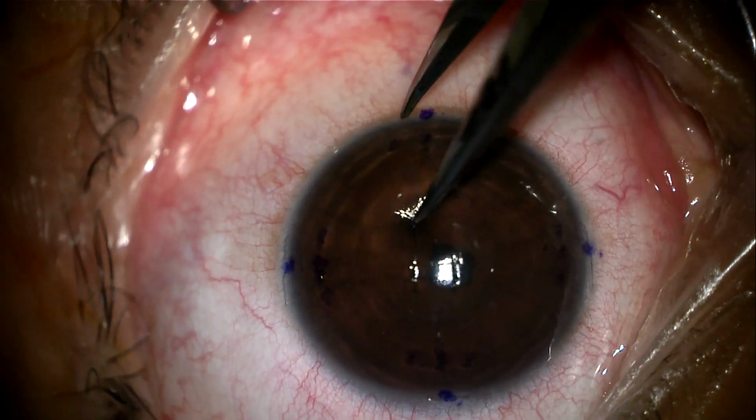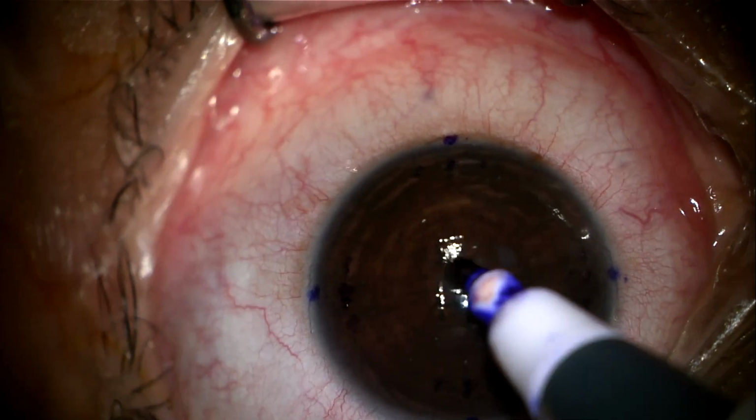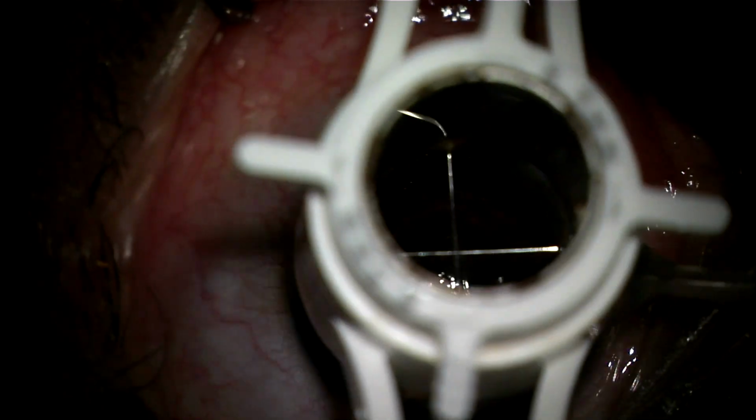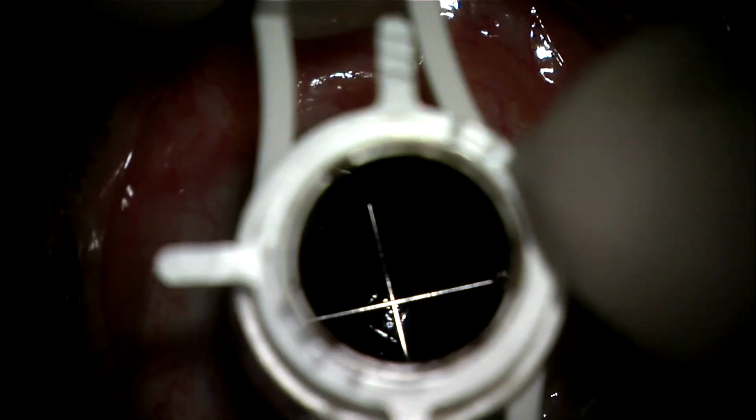DALK is started by marking the 4 cardinal points, then drawing a rectangle at equal distance from the limbus. The center of this rectangle is the anatomical corneal center. This is confirmed by assessing the imprint of the trephine on the cornea. Partial trephination is then done to 70 to 80% of the corneal thickness.